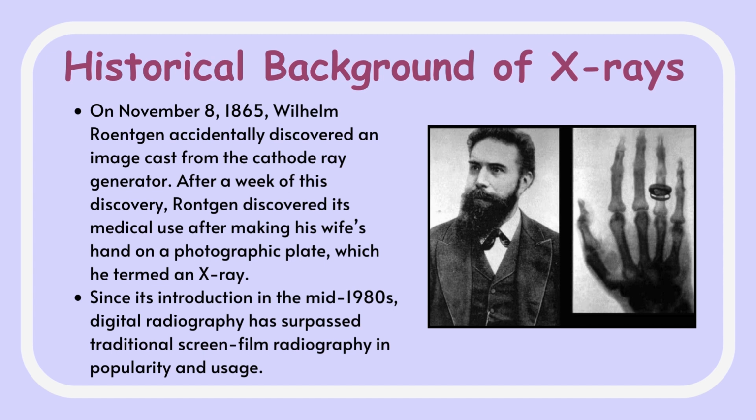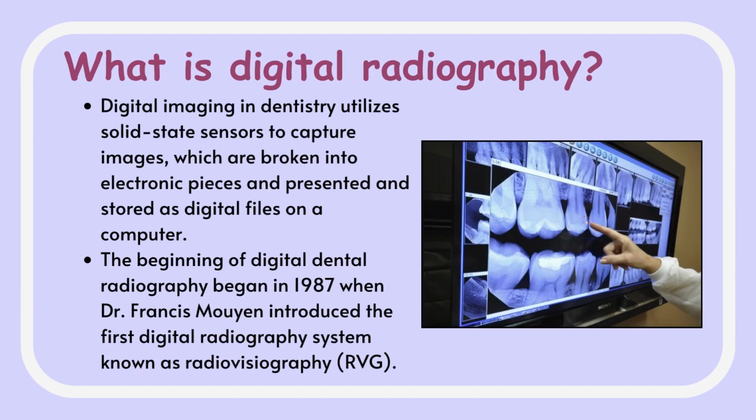Since its introduction in the mid 1980s, digital radiography has surpassed traditional screen film radiography in popularity and usage. Moreover, what is digital radiography? Digital imaging in dentistry utilizes solid state sensors to capture images which are broken into electronic pieces and presented and stored as digital files on a computer.